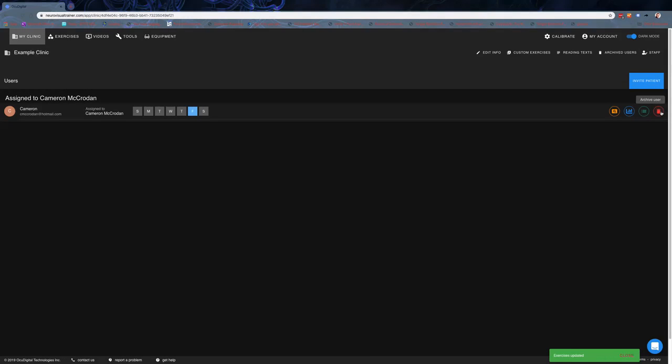The trash can lets you archive the user. So that's basically how to get the staff and users set up. Next thing you're going to want to look at is the exercise library or activity library and how to upload your own custom ones.